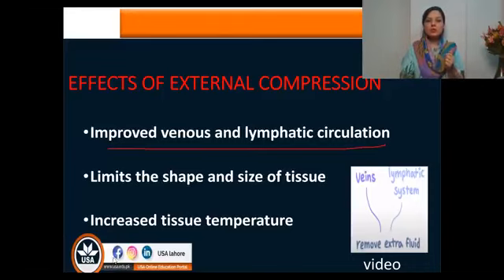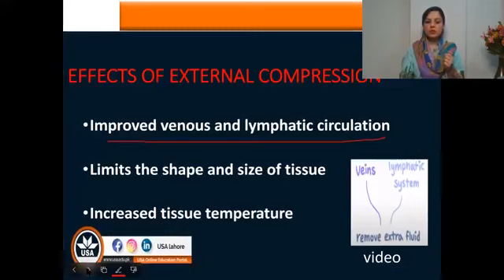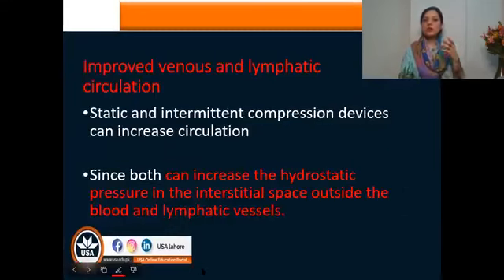So moving towards the first point that I'm going to explain, how compression is going to improve the venous and lymphatic return. Basically, the controlled application of the external compression has a variety of effects on the body part. It varies according to the nature of the device you are going to use, and according to the pressure intensity you are going to apply.